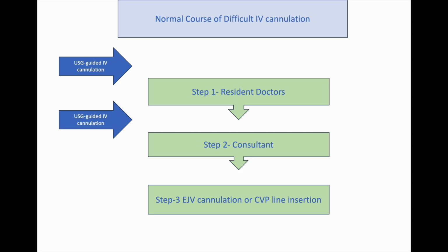So using USG guided IV cannulation, you can significantly reduce the pain caused by multiple pricks, and you can also save the money that would be spent on multiple cannulas or CVP line insertion.